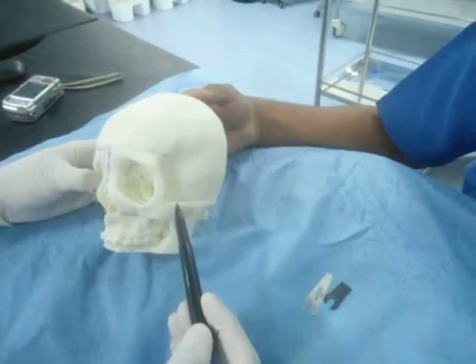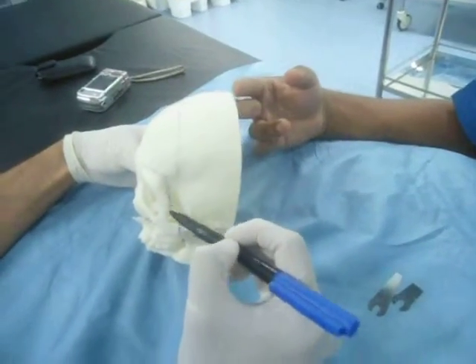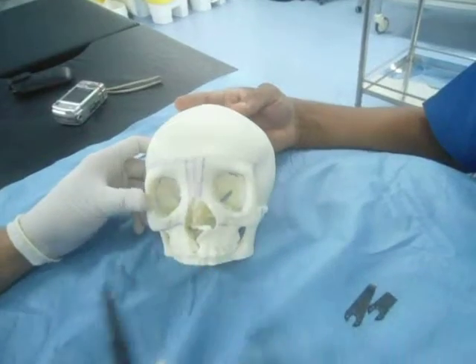This is the planning for the surgery, and our next step now is to follow these cuts and make the movement.